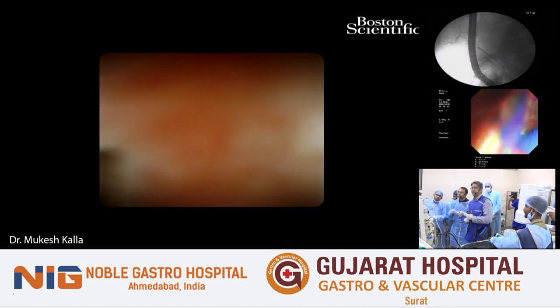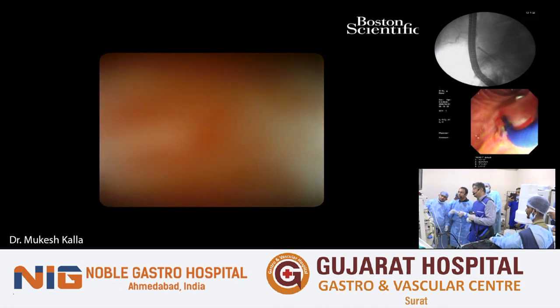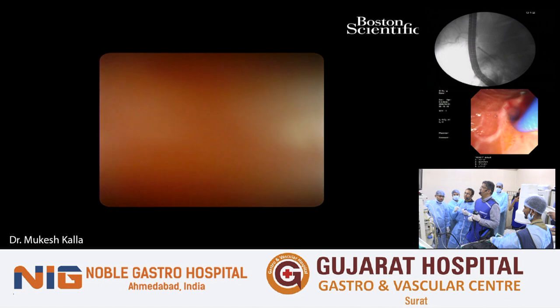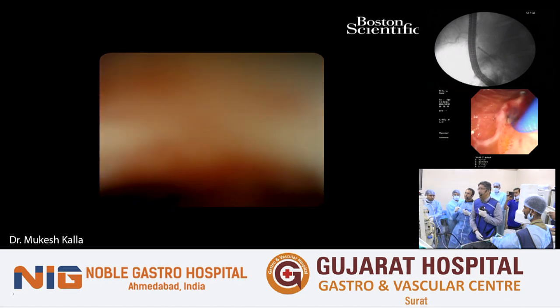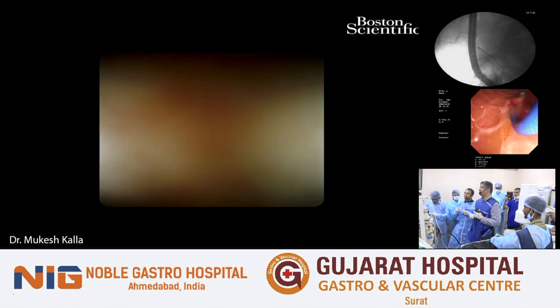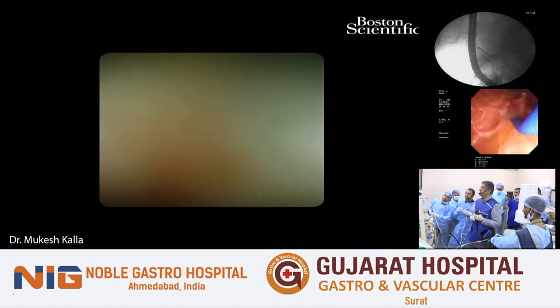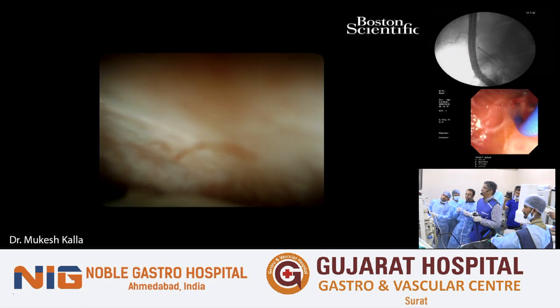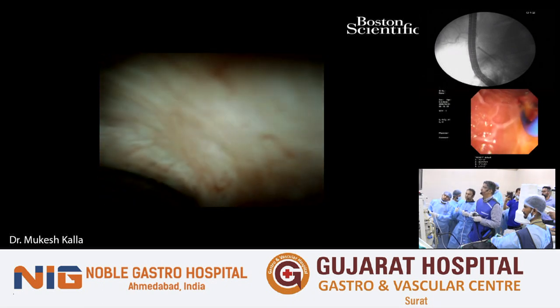So, sir, will you be using a spy basket or are you just flushing and trying to remove it through the cystic duct? Like, see, if it's a small stone, it will just drop into the common bile duct. And if we can't do it, our purpose is to ensure that this patient stays free of stones now because he has already had two ERCPs, one prior and one later.